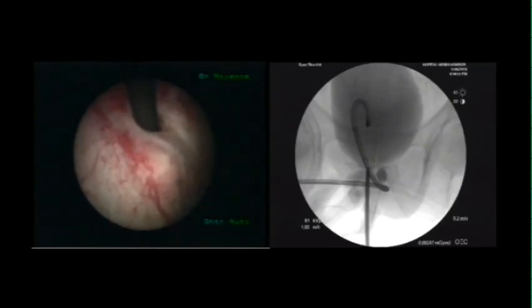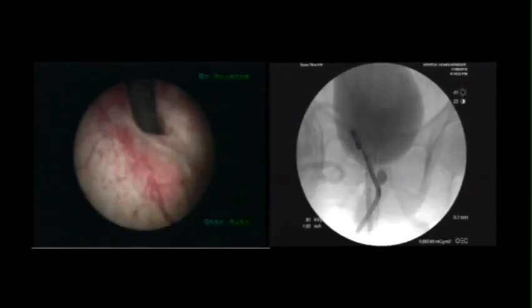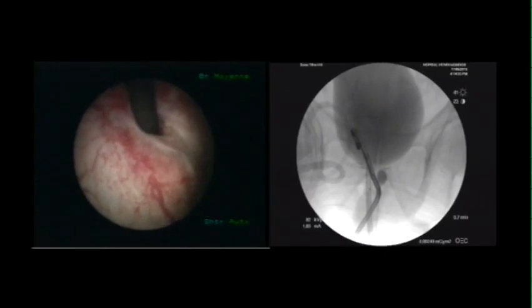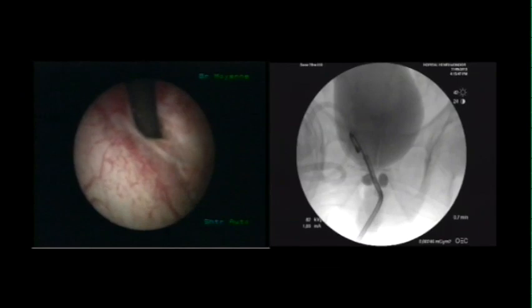Fibroscopic retrovision is used to confirm the absence of bladder perforation. We verify that the two balloons are symmetrical, and the second balloon is inflated.